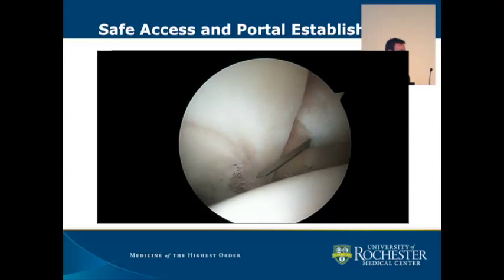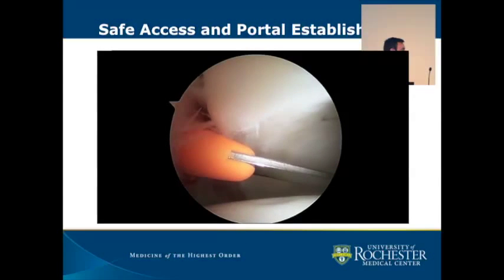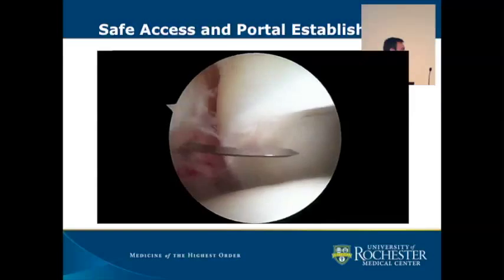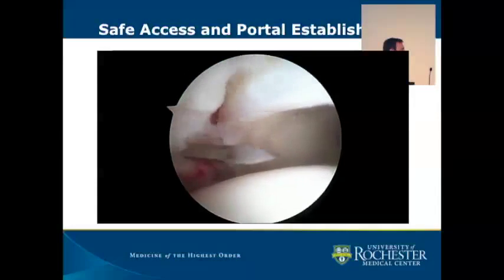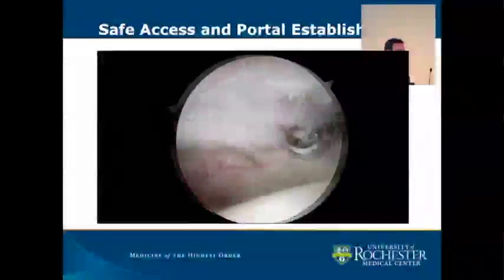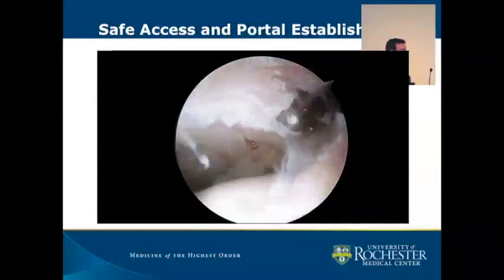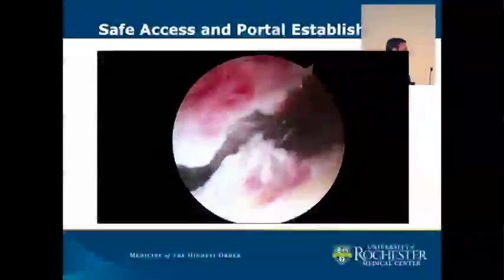Now I've switched. I'm viewing from my mid-anterior portal, looking back at my original anterolateral portal. In this case, I'm connecting my capsulotomies, so you can see the sweep of the beaver blade. I think there are two segments to the capsule: a deeper synovial part and a more stout external part. I'll usually develop this extracapsular space a little bit.